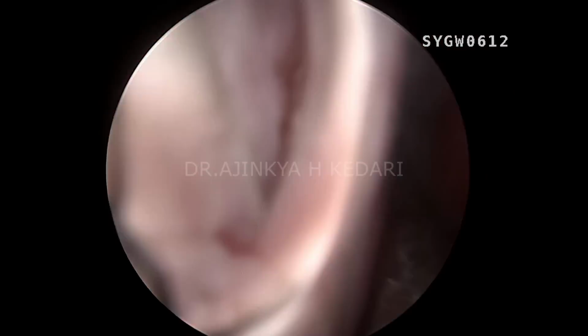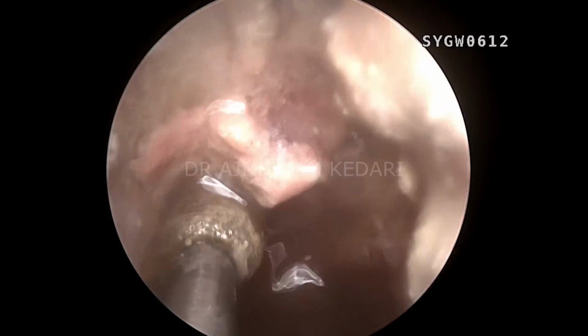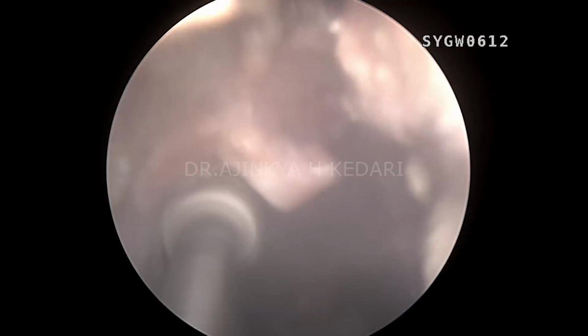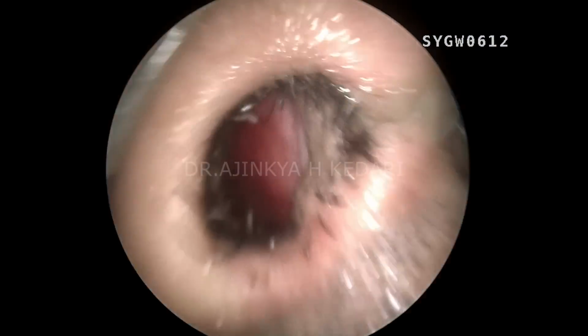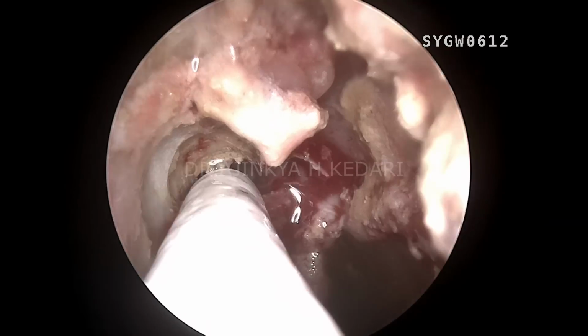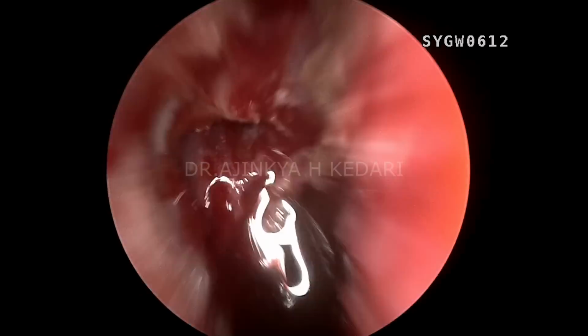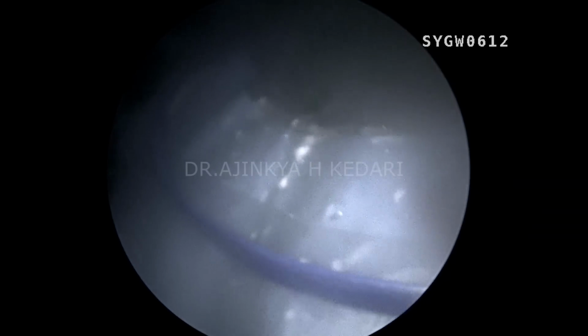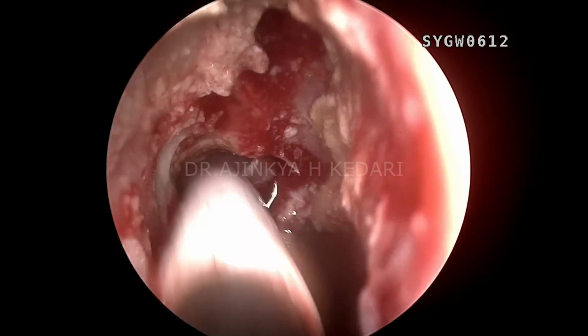So where I'm drilling right now is the frontal beak basically. So the frontal beak will be facing anterior inferior, and the frontal process of maxilla will be on the superior lateral aspect. So you drill all of that, and skin will be the external limit everywhere, superior and lateral. You can see there's a lot of bone that still needs to be drilled superiorly and superior laterally as well. That's the bone right there.